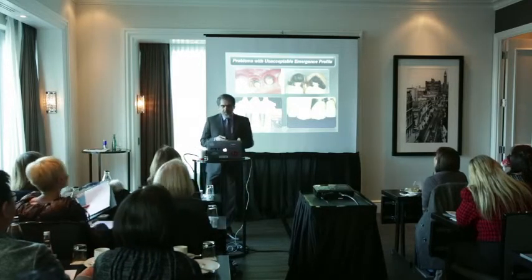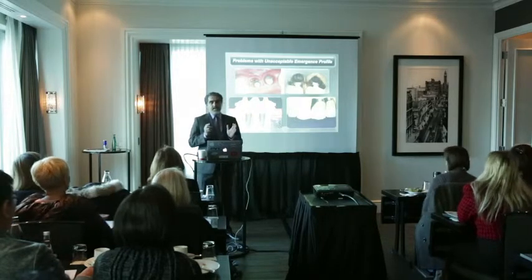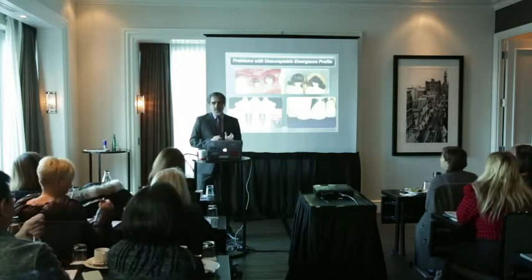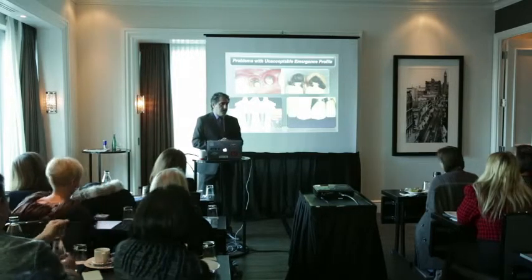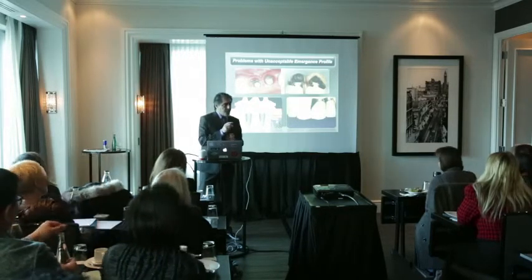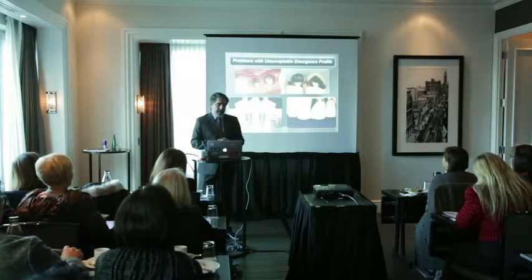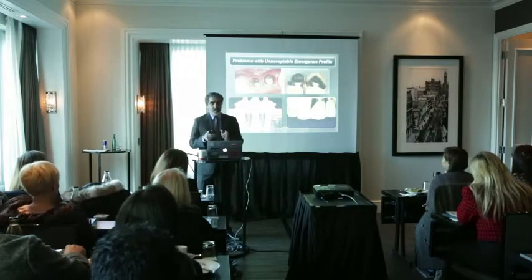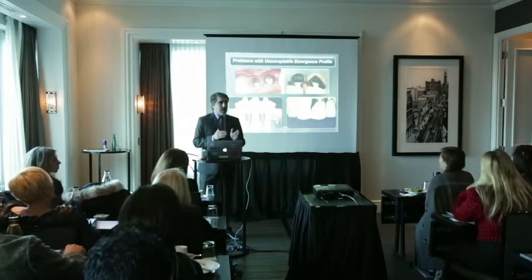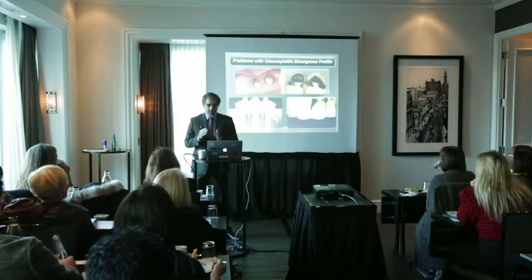So what we have to remember is that emergence profile is an important part of our treatment planning that can cause a lot of prosthetic and biological problems, complications for us. Planning for an acceptable emergence profile will start from the time that the implant is going to be placed.